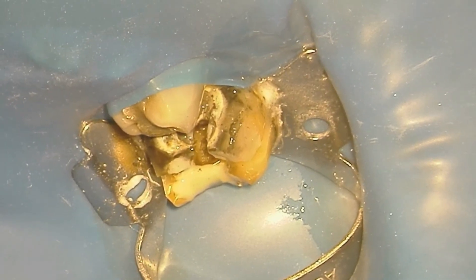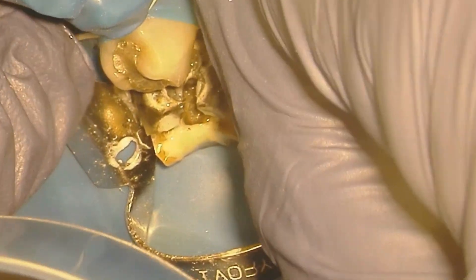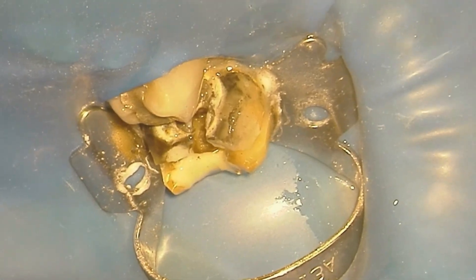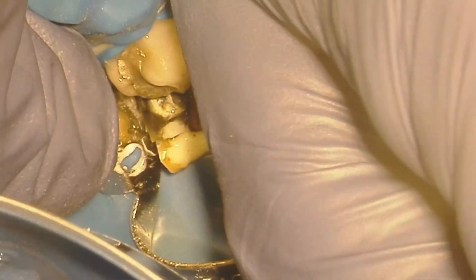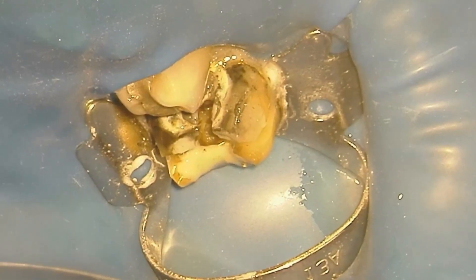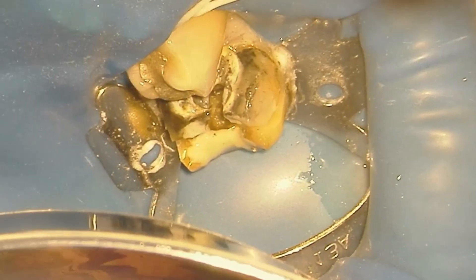Then I'm going to use some floss to push that down through the contact. Do not pull back up straight out — you'll pull the dam with it. Pull out through the buckle or the lingual. Once we get that nice and secured in place, we're going to then take the floss back out through the buckle.